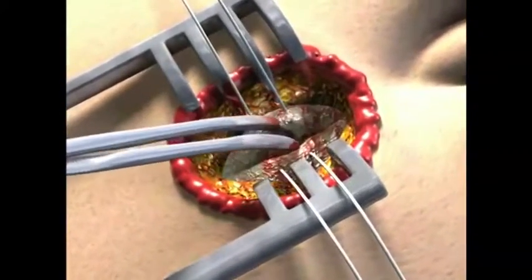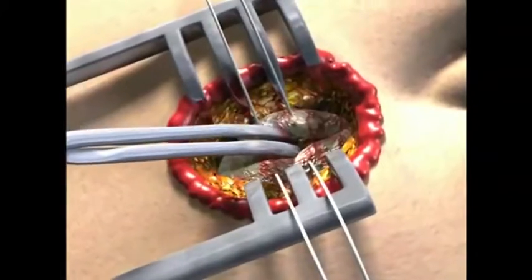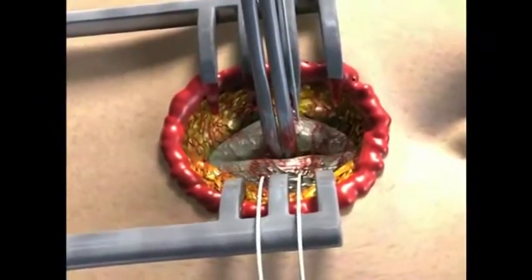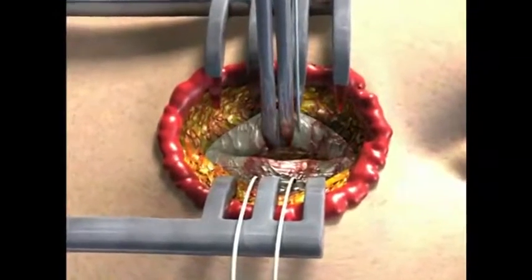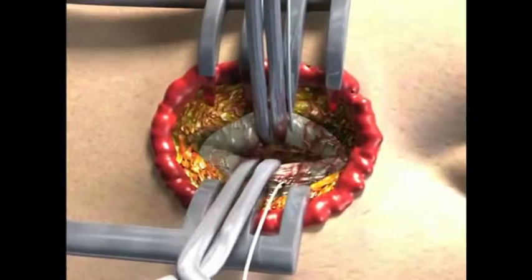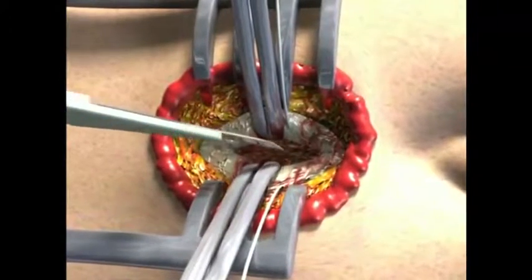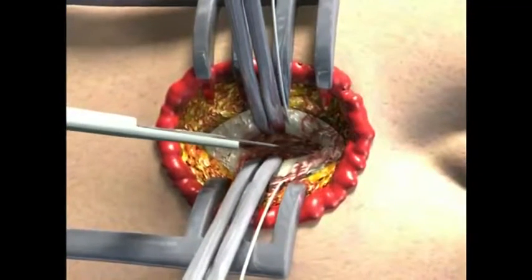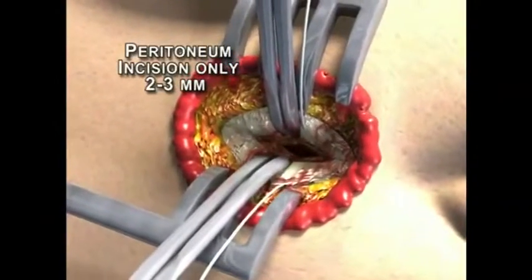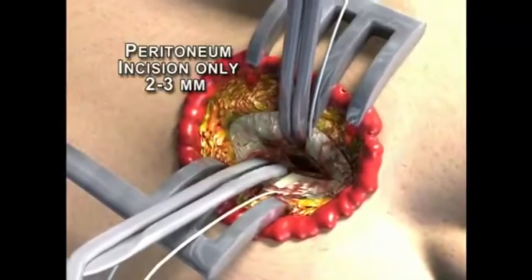The pre-peritoneal fat is then spread with retractors or a hemostat, and the peritoneum is grasped with the hemostat. It is then grasped a second time a short distance away and tented up. The peritoneum is then incised sharply with scissors or a number 11 scalpel. The incision in the peritoneum only needs to be large enough to allow the insertion of the catheter, or roughly 2 to 3 millimeters.